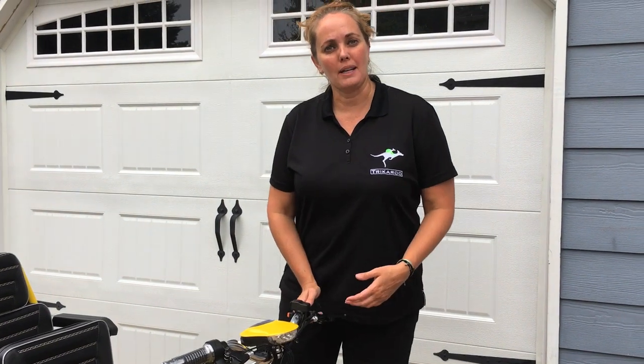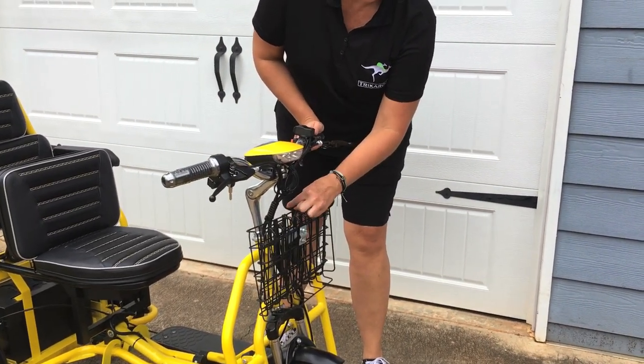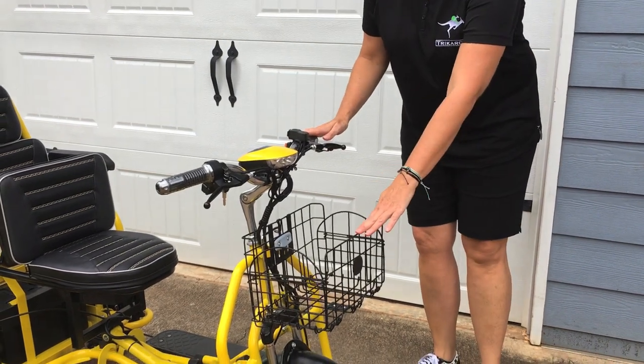Let me show you how the front basket works. Under the latch up top, let the basket go — it is spring loaded. You'll want to make sure the sides clamp in for safety and you're good to go.